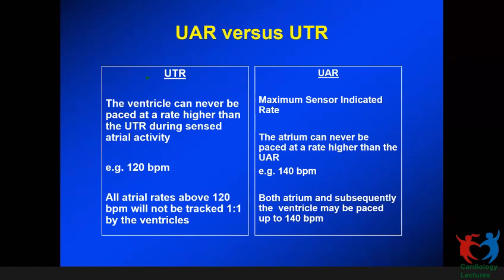And then the other question, when should we program MTR and MSR differently? When to keep MSR higher? I would request Dr. Raja to comment on that. I think Govind covered it to some extent, but essentially you think what you want to do.